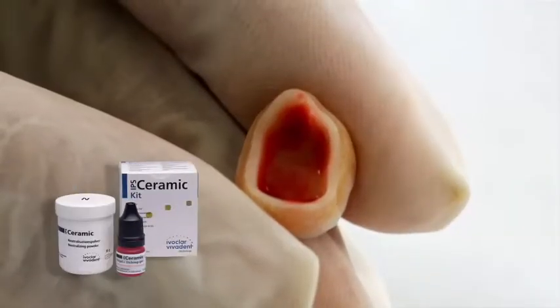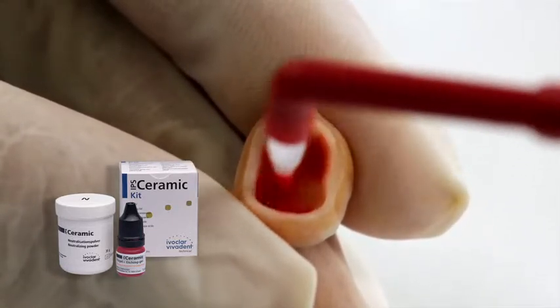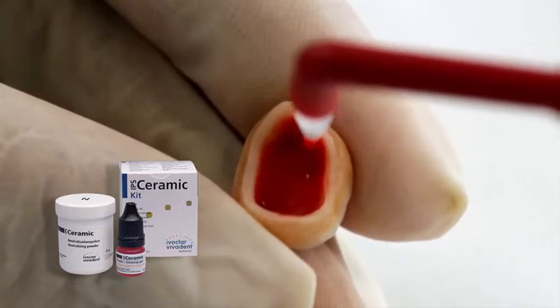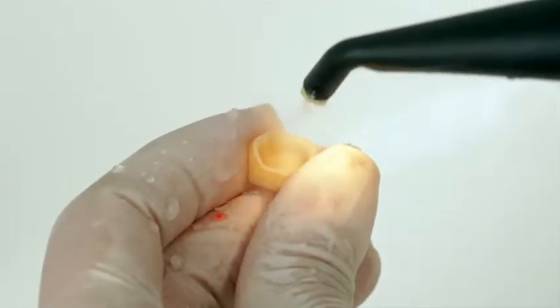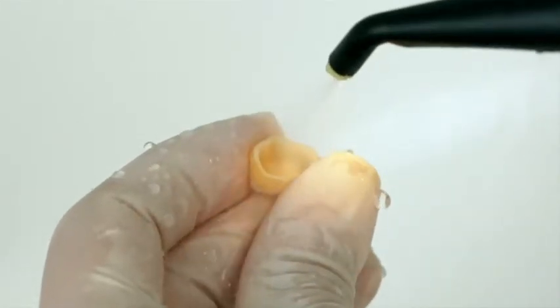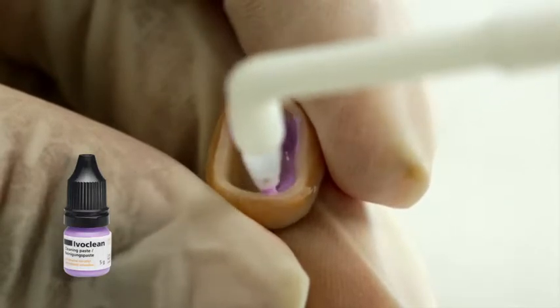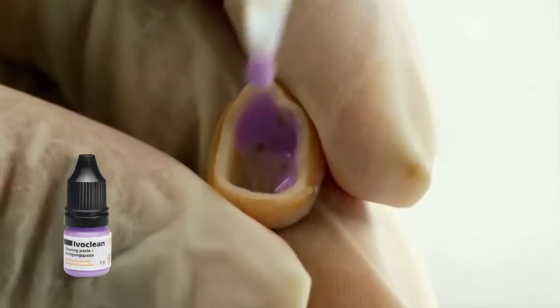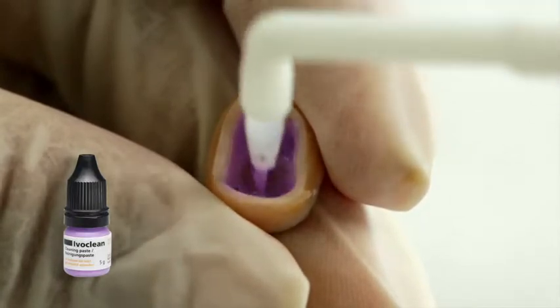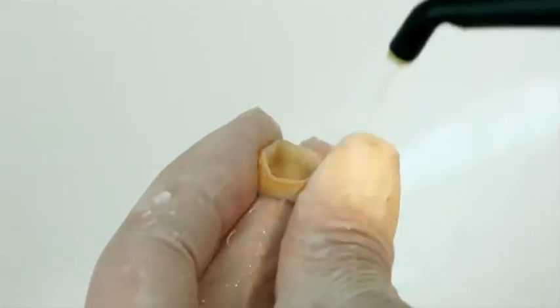Etch the bonding surface of the restoration made of IPS e.max with 5% hydrofluoric acid, such as ceramic etching gel, for 20 seconds. Subsequently, rinse off the etching gel and dry the restoration. If the restoration has already been etched in the lab, clean the bonding surface with Ivoclean. Apply Ivoclean to the entire bonding surface and leave to react for 20 seconds. Subsequently, rinse it off and dry the restoration.